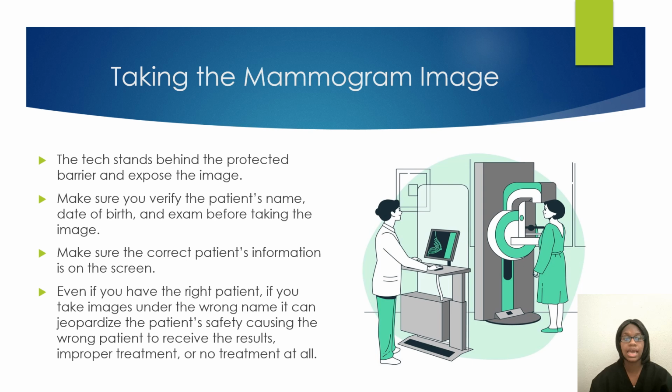Whenever you are taking the actual mammogram image, make sure that you confirm the patient's name, date of birth, and what exam you're doing. Match it up to their wristband if they have one on. Match it up to their order. Take their order and match it up to the actual computer.